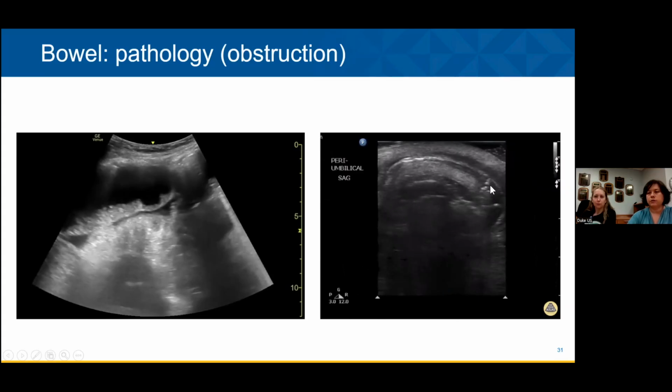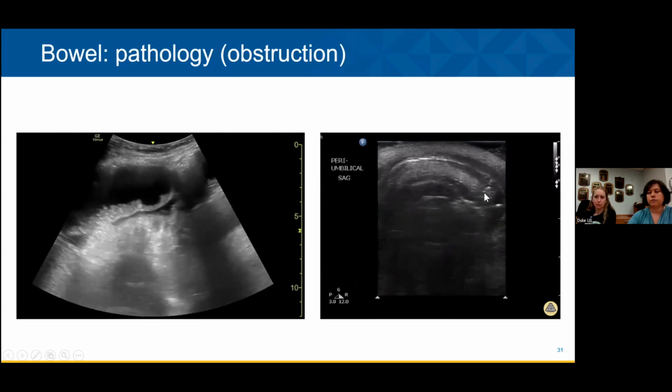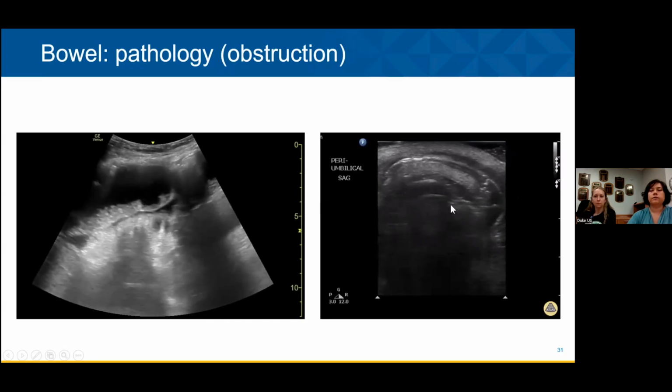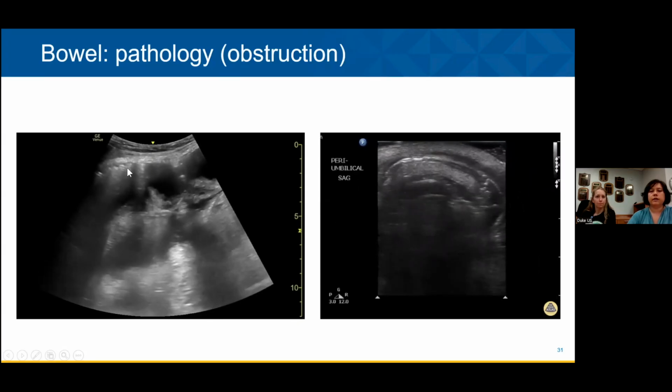And there are a couple of small bubbles here that you can see actually going through the different mucosal layers as well. So these are very atypical findings. You shouldn't see air within the wall itself. And that's why I showed this is air that's inside the lumen, and it can be kind of subtle.